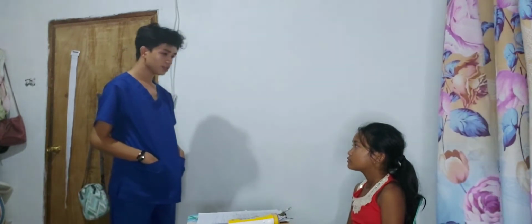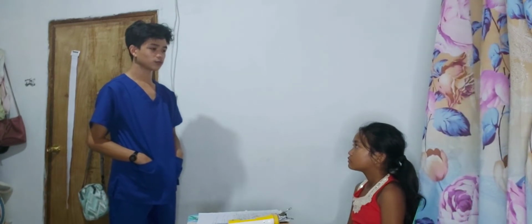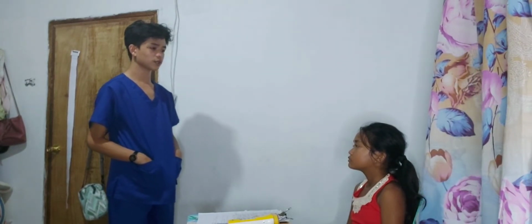After that, we're going to explain the procedure that we're going to do. The purpose of this, ma'am, is for us to be able to check or observe your ear if there are any abnormalities that we can see, and also if meron man, for us to be able to maagapan or give immediate care agad. Okay po?